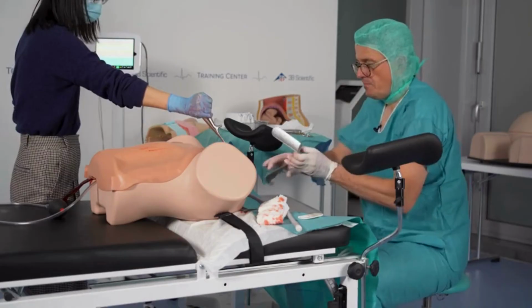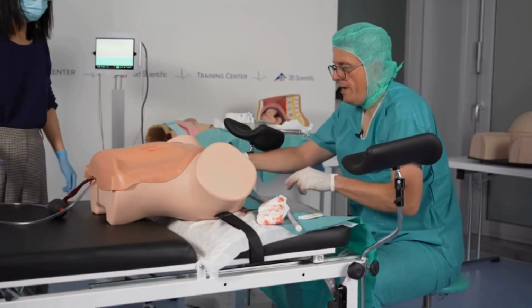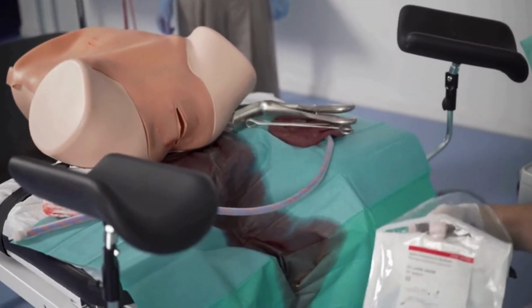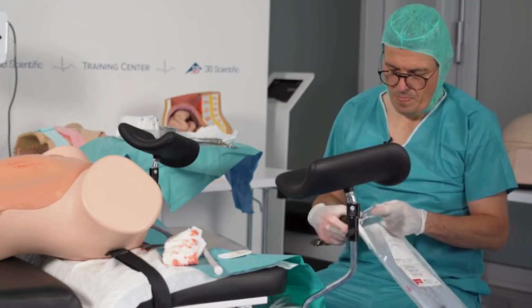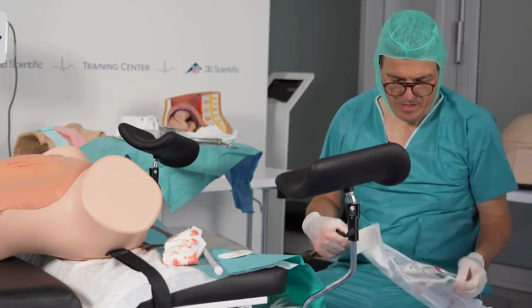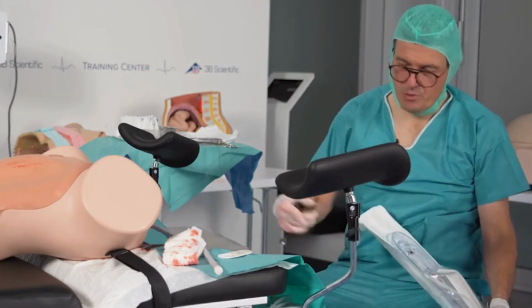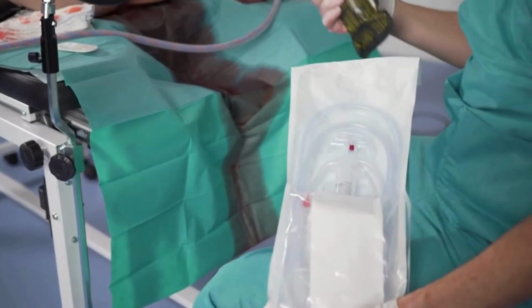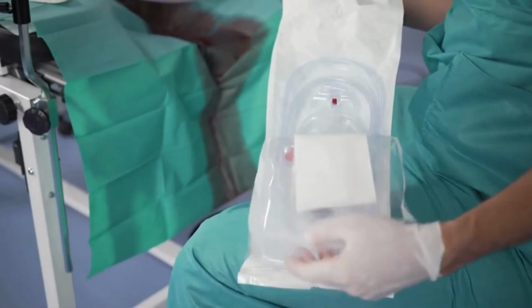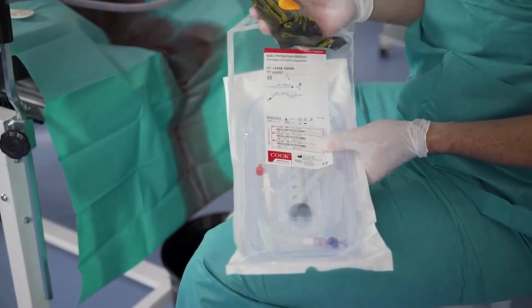And we have two ways to do a packing. One is that you take the Bakri balloon, and of course the whole system can easily be used to train the insertion of a Bakri balloon and fill it completely, or you can use Celox.